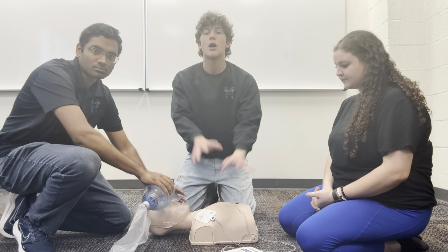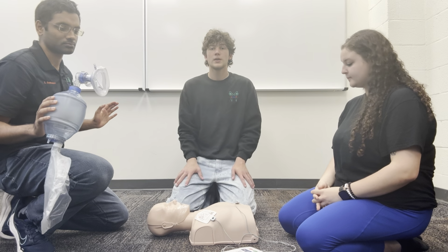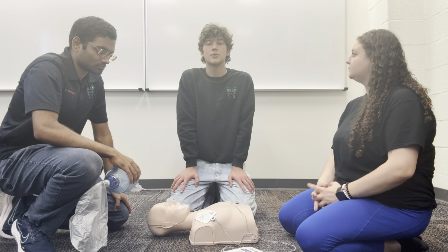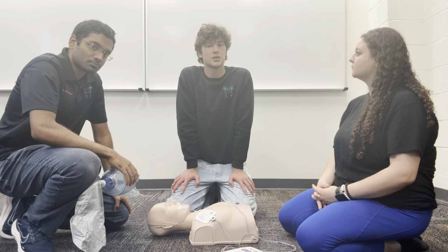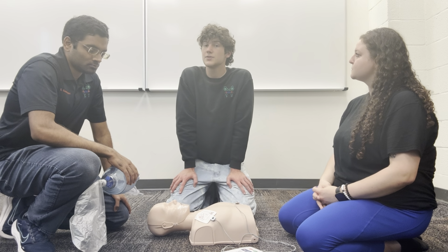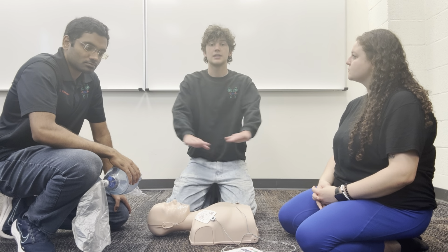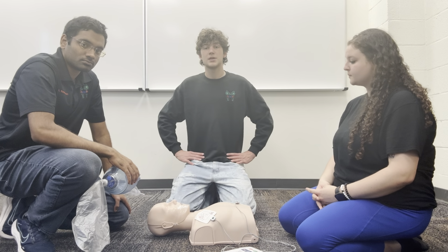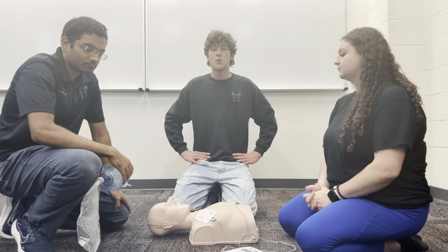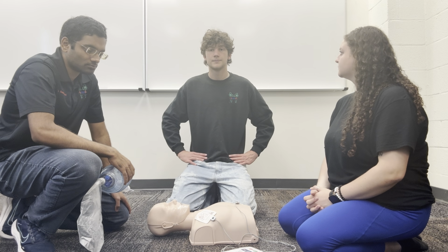At this time, all individuals will remove their hands from the patient to prevent interference. Once this is complete and the AED says rhythm analyzed, you will check a pulse to make sure that the patient's pulse has not returned over the course of CPR. If the AED says shock advised, continue CPR until it is done charging. Once the AED is charged, make sure to clear all participants and people in the resuscitation attempt from the party receiving the shock. Once you defibrillate, immediately check a pulse and return to CPR.